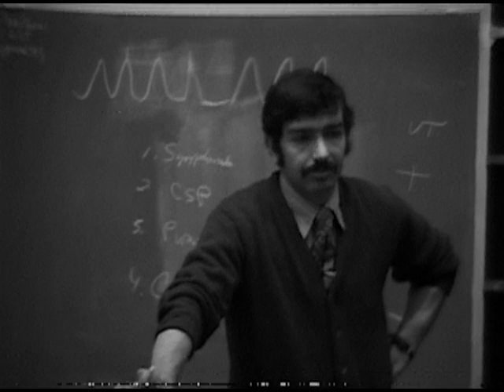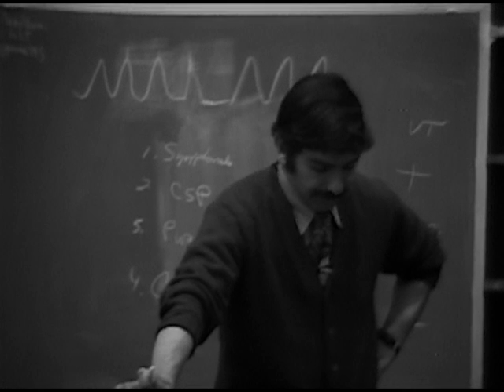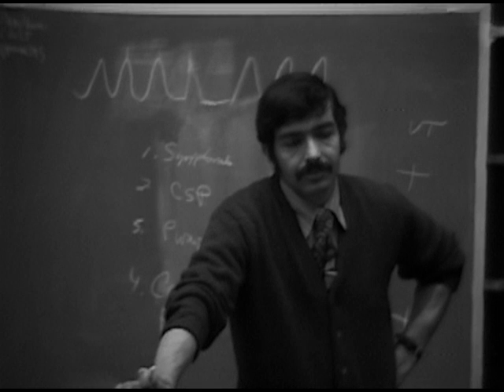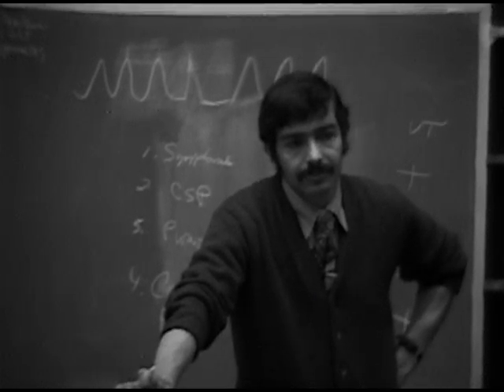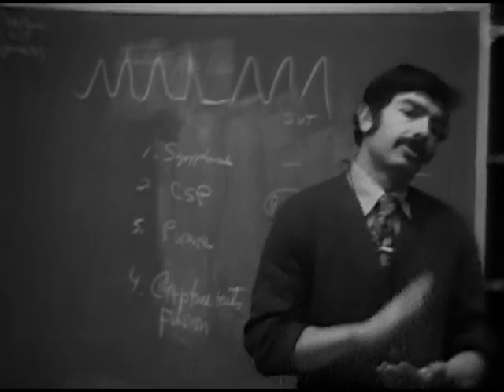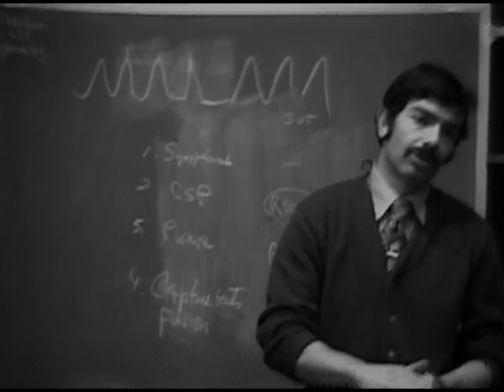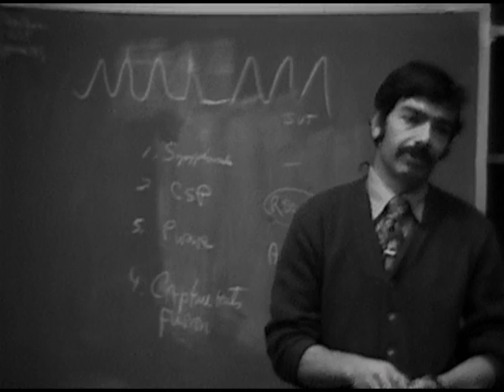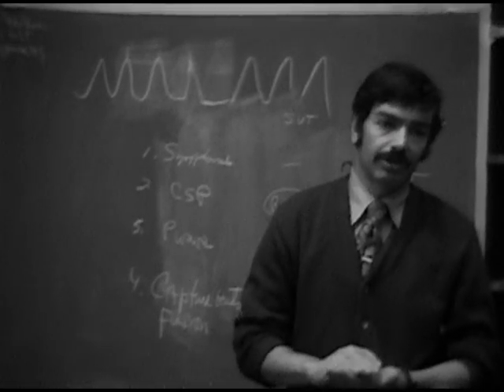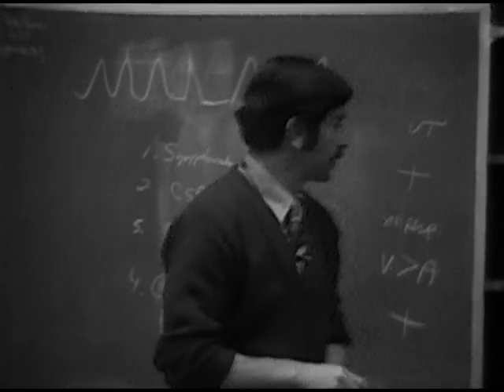You know, the thought is that if you have a regular atrial rate and a regular ventricular rate, which are different, mathematically you should expect an atrial beat to come down after the refractory period to the ventricles on a regular basis, assuming conduction is normal. When you have something like a nodal rhythm with an AV dissociation, with your nodal rate going at 80 and your atrial rate going a little bit slower than that, then you may see your capture beats occurring at very regular intervals. But at these rapid ventricular rates, it's unusual, though possible, that you may see regular capture or fusion.